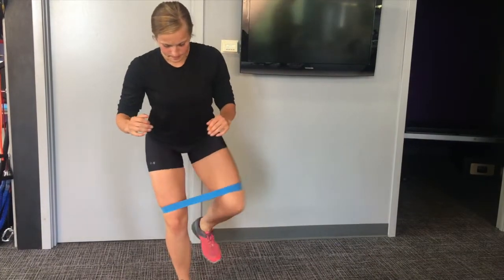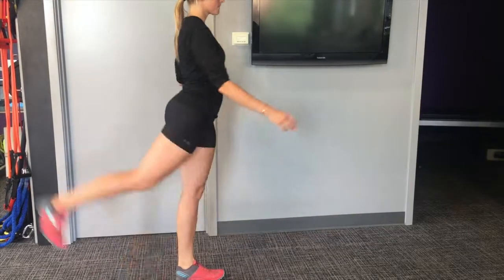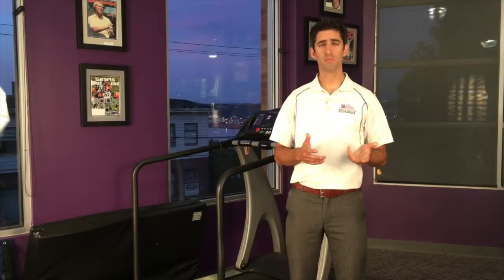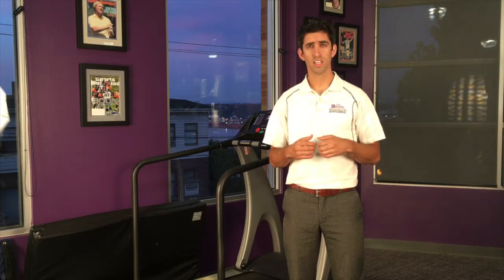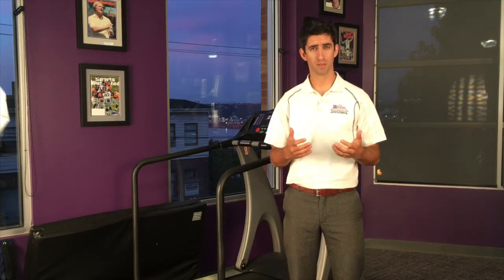We know that strengthening and stretching muscles can help alleviate some pain, but we also know that corrections to your running technique need to be addressed to give you the best chance of running without pain. The small movements that happen during running happen too fast for our eyes to see at normal speed. That's one of the big reasons that we use video to do the analysis. It gives both your therapist and you a much better view of what happens during running.